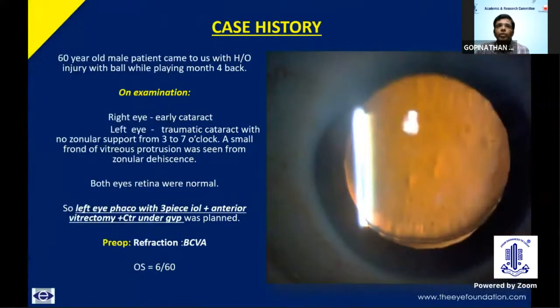Today I would like to discuss with you a case of traumatic cataract with zonular dialysis. Our patient was a 60-year-old male with a history of injury to the left eye with a ball while playing, four months back. On examination, he had right eye early cataract, and left eye traumatic cataract with no zonular support from 3 to 7 o'clock position, with only a small frond of vitreous coming from the zonules. Both eyes' retinas were normal, so we planned to go ahead with left eye phaco with 3-piece PCIOL plus anterior vitrectomy with CTR under guarded visual prognosis. Pre-op refraction was improving only to 6/60.